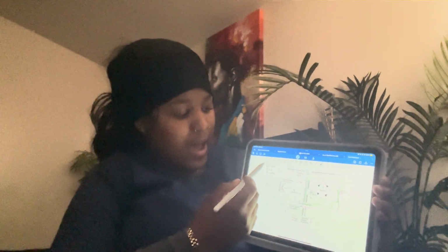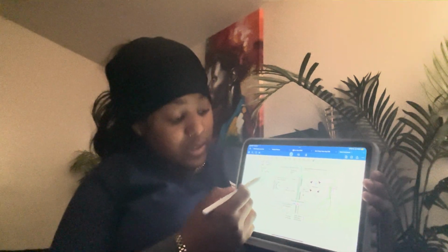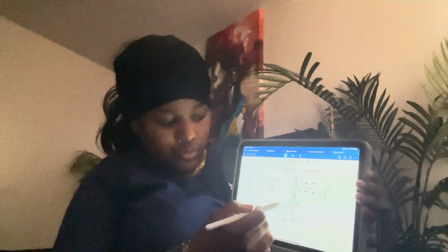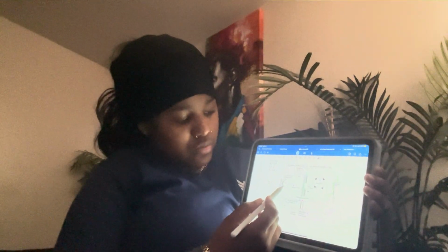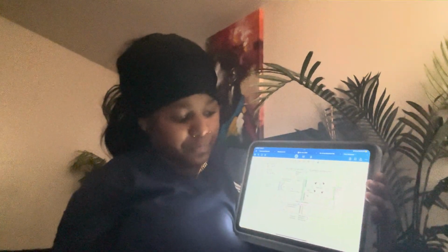As said, I have 65 kVp. So this allows for the voltage to contain kVp selection and voltage and so forth, and that's when it's flowing through the X-ray circuit. This also includes self-induction and alternating current.